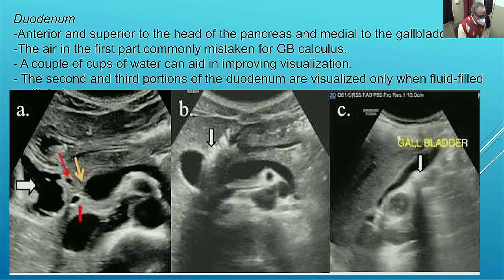Contrary to the belief that ultrasound is not good for bowel, being an air containing organ, if you apply techniques, you can certainly get information, and many times surprises do come while doing ultrasound abdomen in case of various abdominal pains or other symptoms.